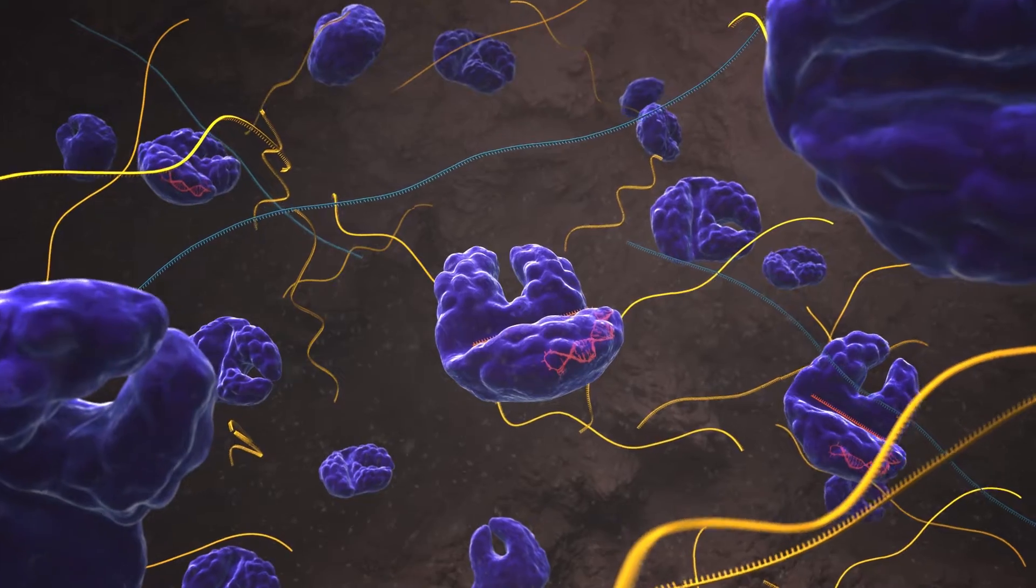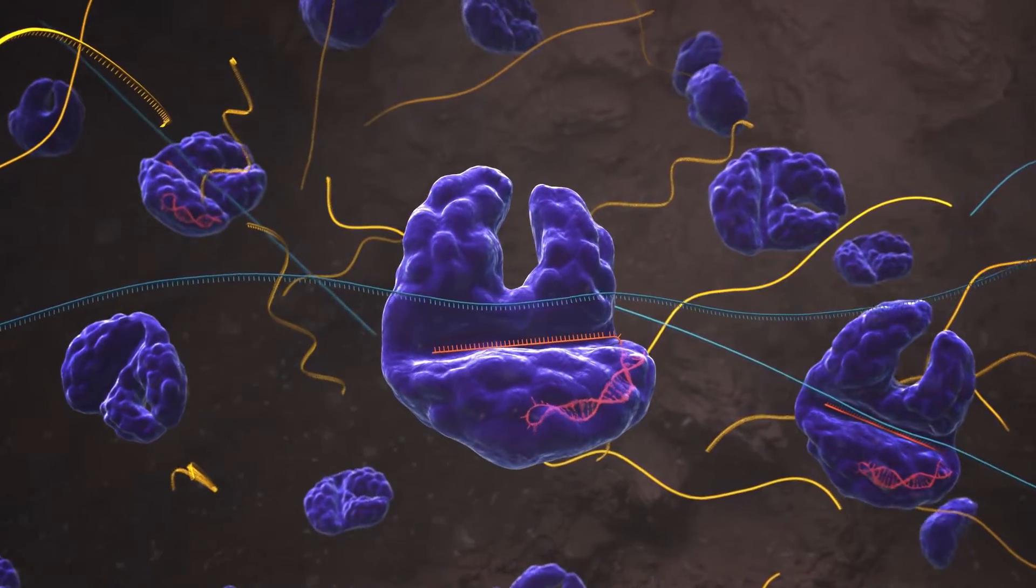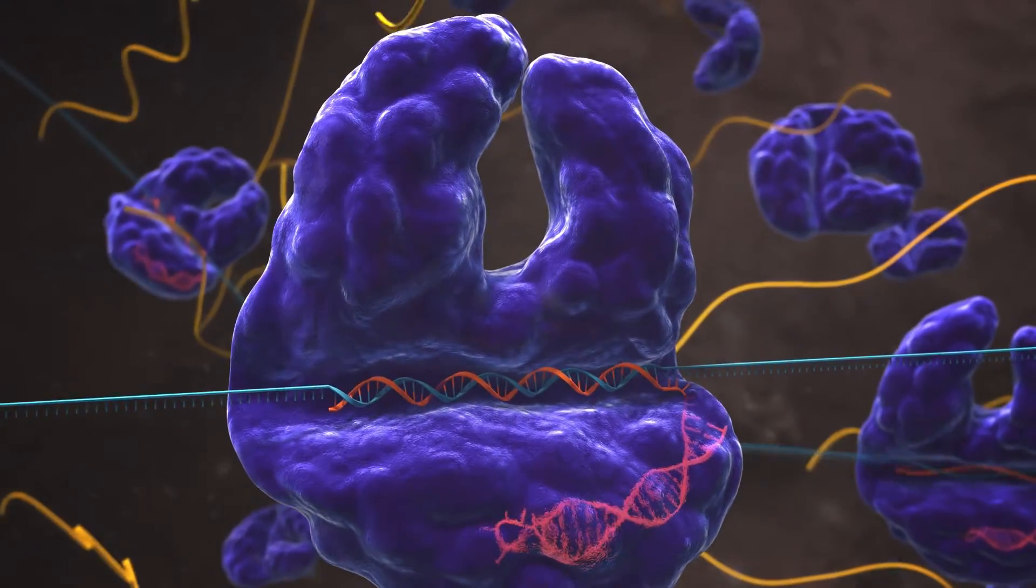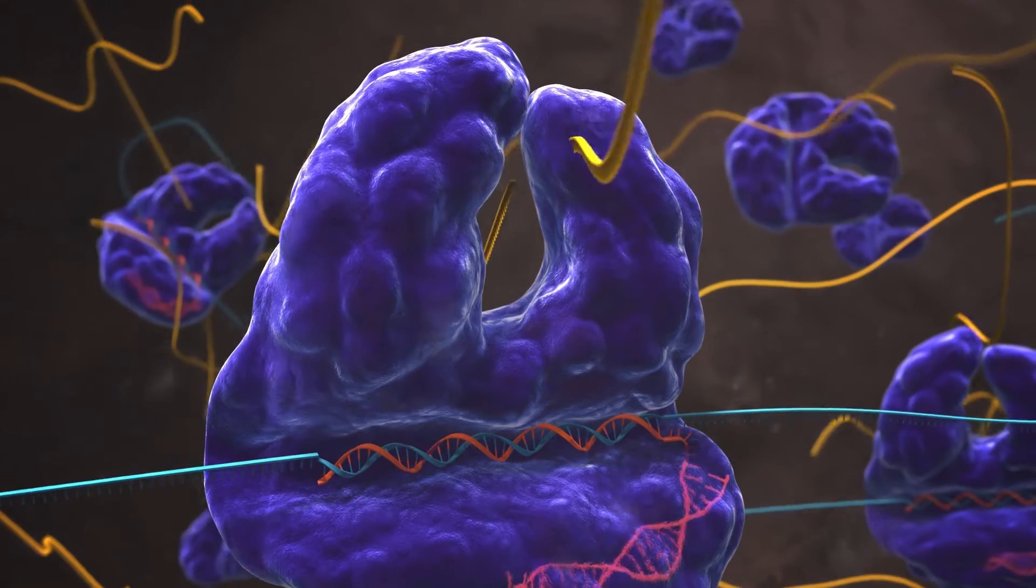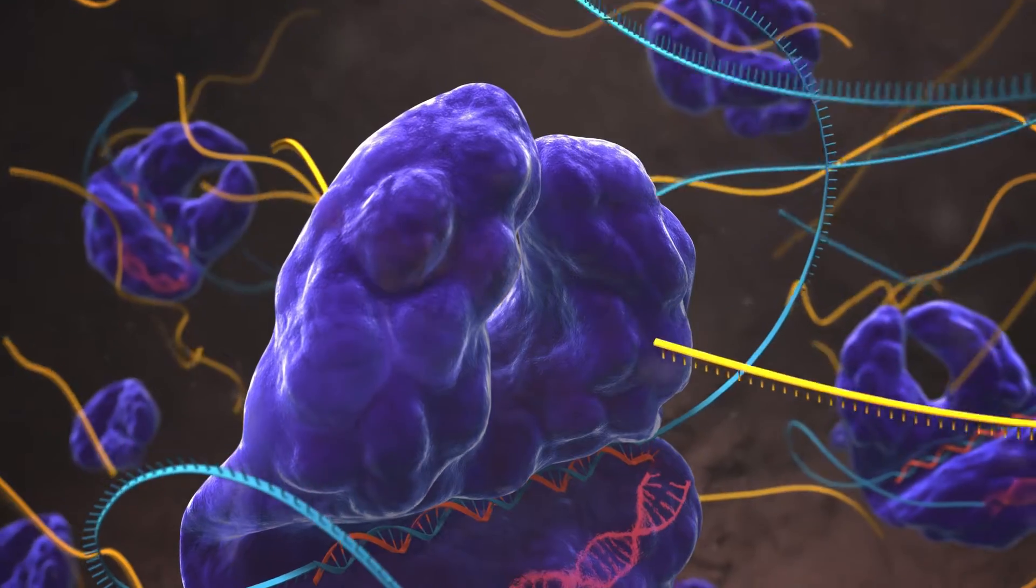Here's how Cas13 works in its natural environment. First, it hunts for viral RNA using an RNA guide. When it finds its viral target, Cas13 becomes activated. In some circumstances, it cuts any RNA it encounters, a process termed collateral cleavage.